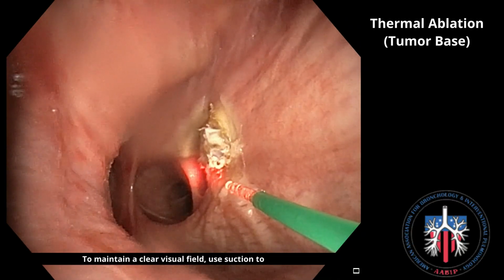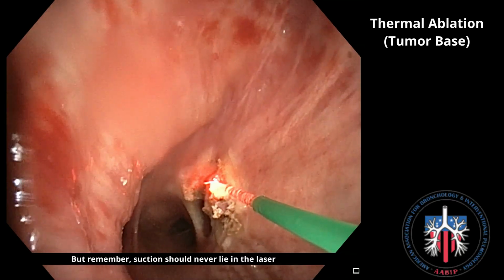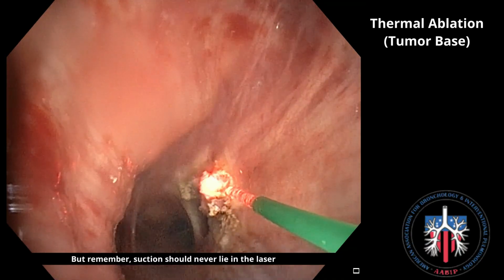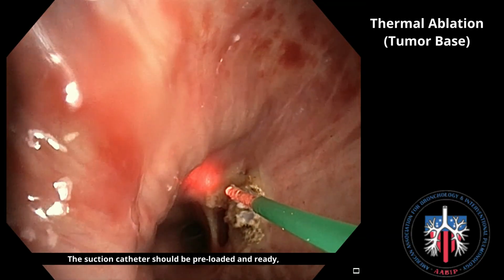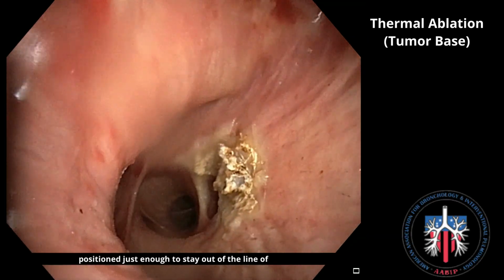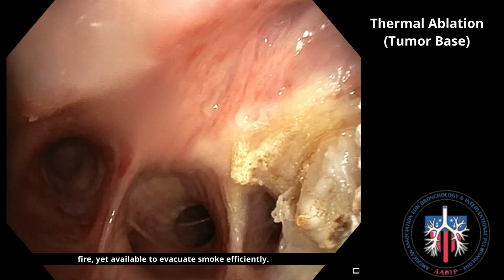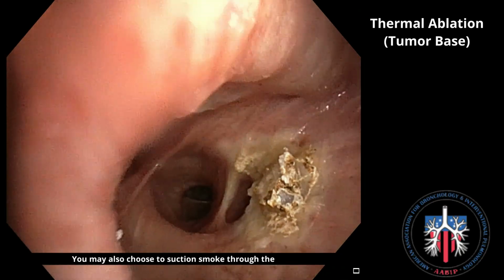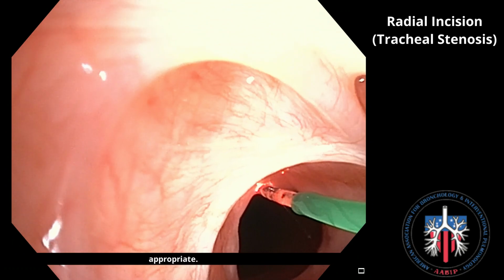To maintain a clear visual field, use suction to remove smoke. But remember, suction should never lie in the laser field. The suction catheter should be preloaded and ready, positioned just enough to stay out of the line of fire, yet available to evacuate smoke efficiently. You may also choose to suction smoke through the working channel of the flexible bronchoscope when appropriate.